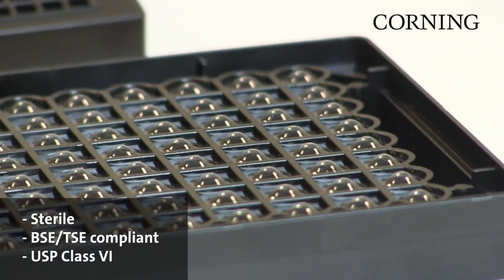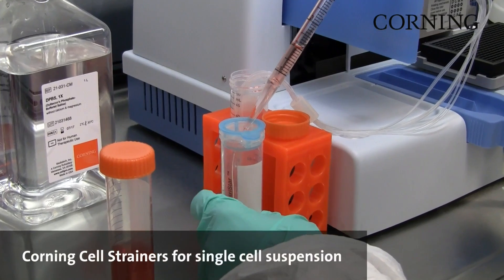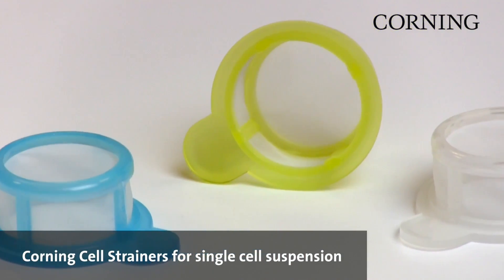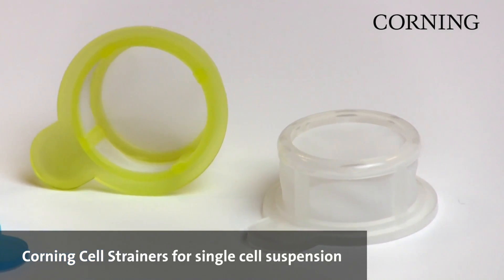Corning spheroid microplates are sterile and manufactured to high quality standards. To strain cells to achieve a single cell suspension, we also offer Corning cell strainers in 40, 70, and 100 micrometer mesh sizes, which fit in all major 50 milliliter centrifuge tubes.